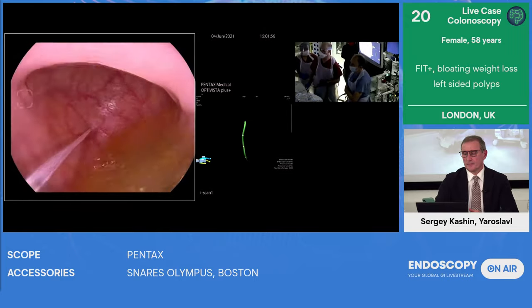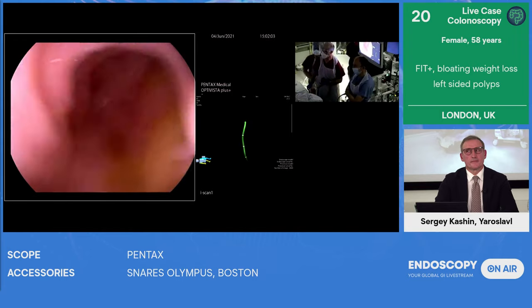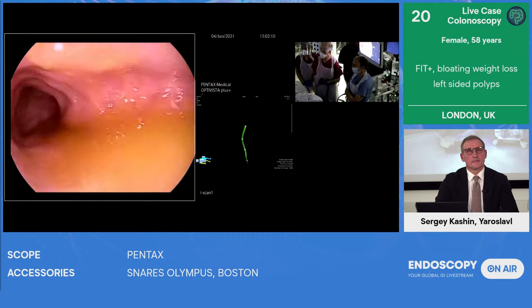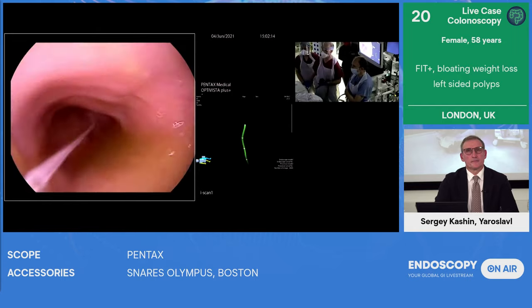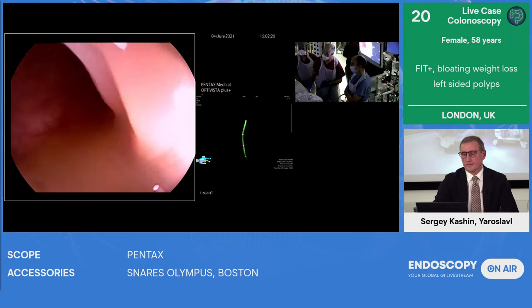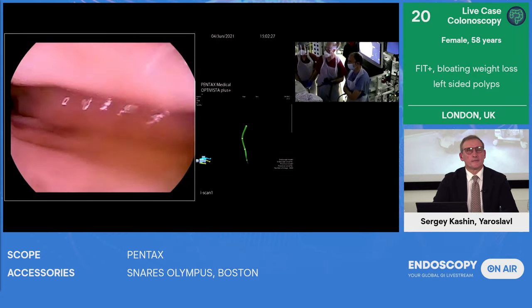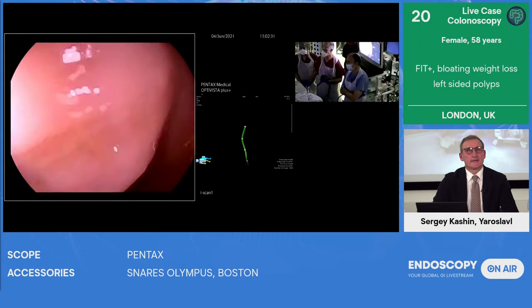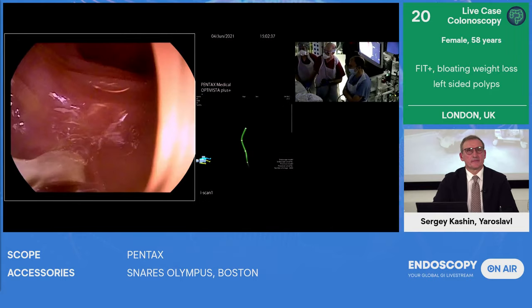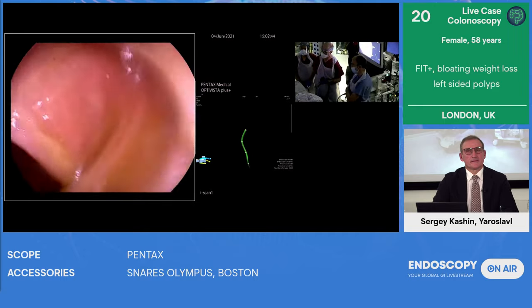It's certainly data that's planned to be collected in the UK on every endoscopy, whether the procedure was done with AI or not. And you would imagine it's a step away from being a quality metric. And I think from a patient's point of view, if you know that AI is going to improve your adenoma detection by 30%, then you'd want AI, even in Professor Saunders's hands. That is a very big increase in ADR. I think that's unlikely. Depends where your starting point is. But yeah, I think it makes sense to me. And I think patients are becoming increasingly aware, and certainly I consent for missed lesions whenever I consent for an endoscopy. It's an issue.